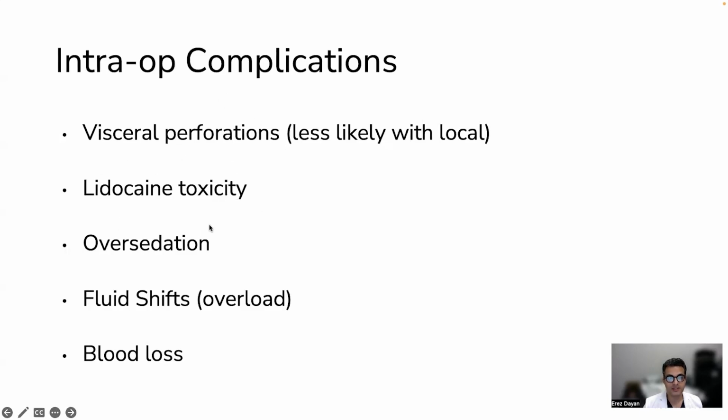Lidocaine toxicity, we'll discuss that, but you really want to ensure that you're under the limits for local. You want to make sure that that's documented. You'll see in our intraoperative paperwork you're provided, it says specifically what was your concentration of lidocaine, how much did you infiltrate, how much did you aspirate. You certainly want to make sure the patient's not over-sedated where you may have an airway issue. Remember, this can be done completely awake under strictly local anesthesia. So you're not looking for deep sedation on these patients or uncontrolled sedation. You just want to take the edge off.